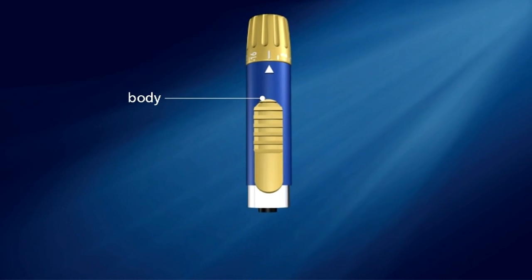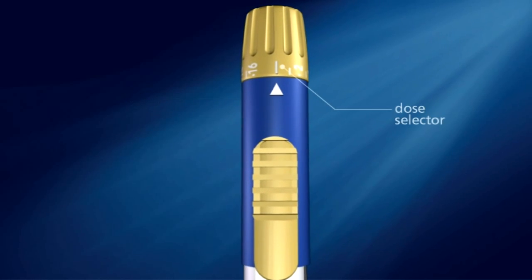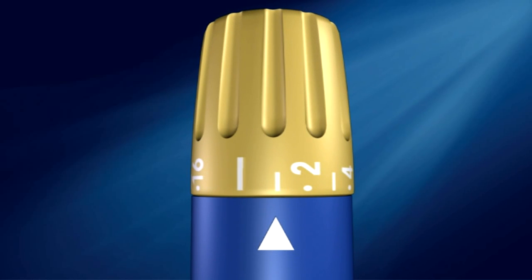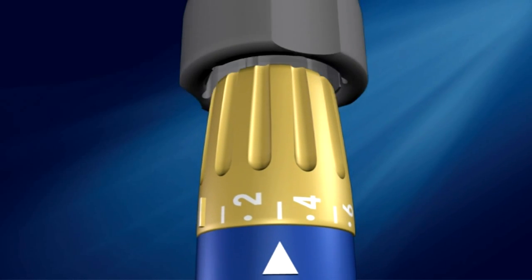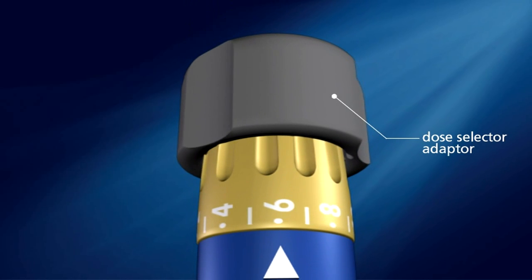The main body of VetPen is ergonomically designed for easy handling. The dose selector allows you to provide precise doses simply by turning the dial. This reduces the chance of error by eliminating the need to manually draw insulin doses from a vial with a syringe. Never attempt to forcefully dial back the dose selector, as doing so may damage the pen and result in inaccurate dosing. The dose selector adapter may be used to provide a better grip when selecting a dose.